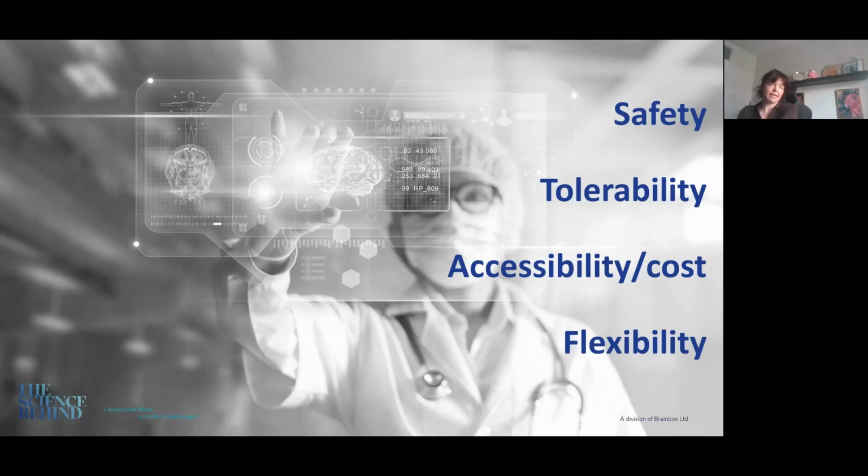Or can you bring the technology and the hardware and the software you need into the setting where you plan to do the trial? And is that cost effective, particularly when you have to do one measure in a very large sample or multiple measures, even in a small sample? The costs can really add up for some of the ways that we look at measuring central nervous system function.